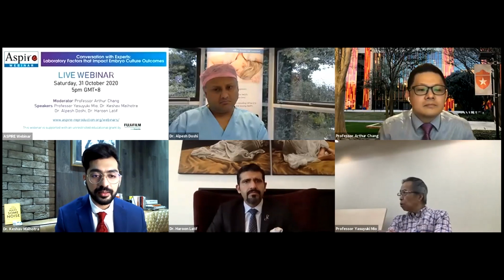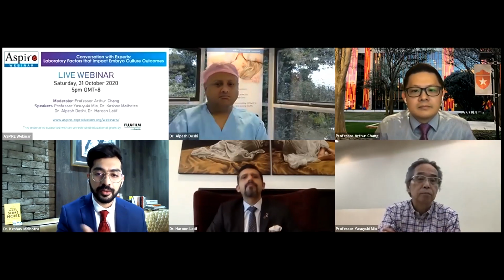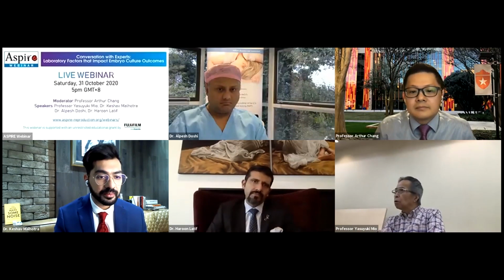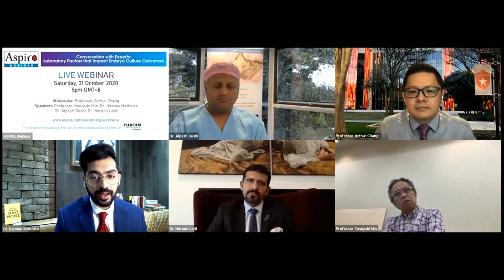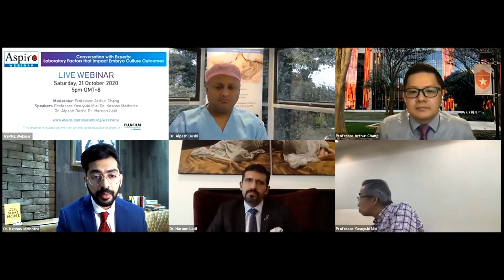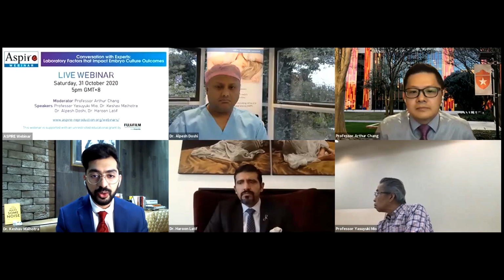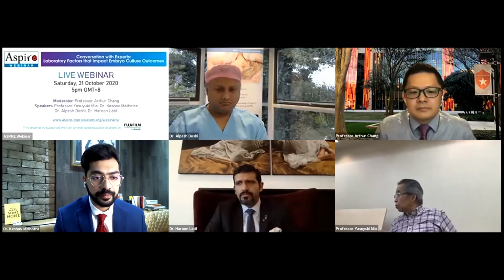In normal culture conditions, at normal culture parameters, if you're maintaining the same oxygen tension and using the same kind of media, which we generally are, I really don't think it should be that different, and we could be using the same scoring systems. I have a time-lapse in my own laboratory. I use the KIDScore, but I also use my own morphological assessment, and then use both of those parameters to select the best embryo to transfer.